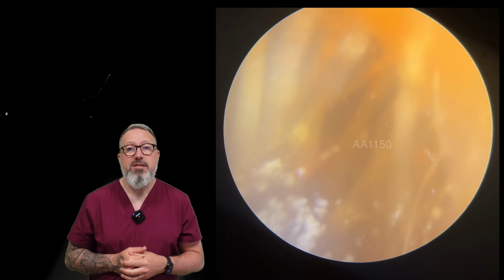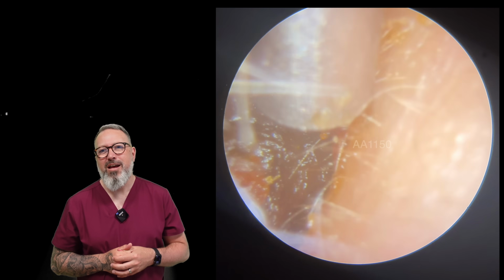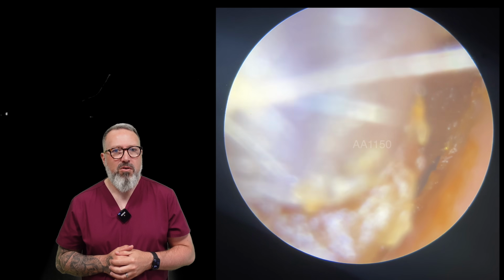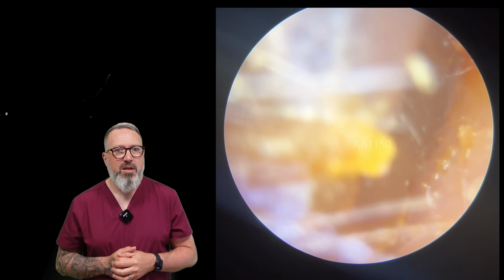So this last patient, this is Taylor's patient now. Doesn't look like there's much skin on this one. They've broken a trend at the end, but a much thicker plug of wax here. Looks a bit on the sticky side. So let's see if we can just pull. There we go.